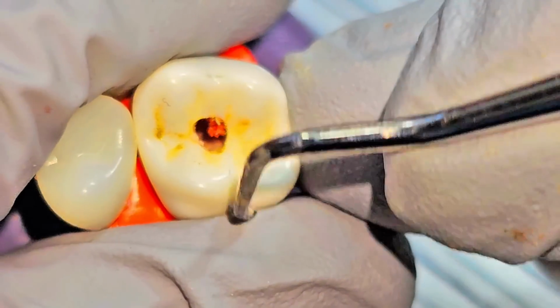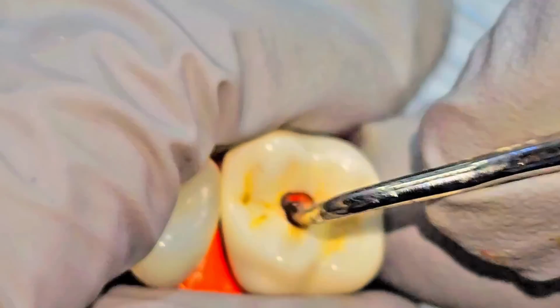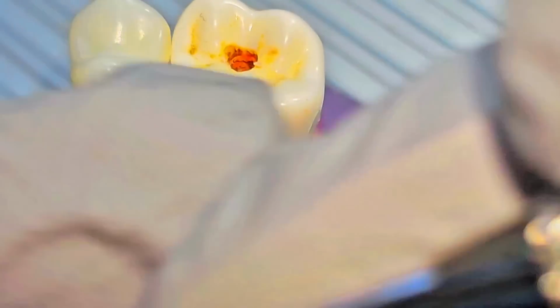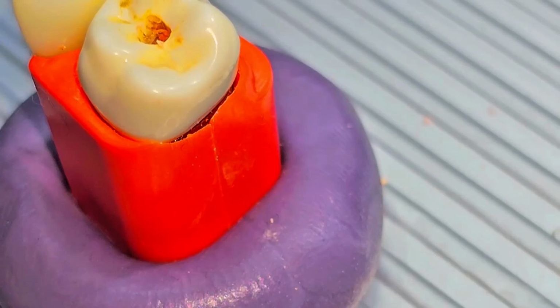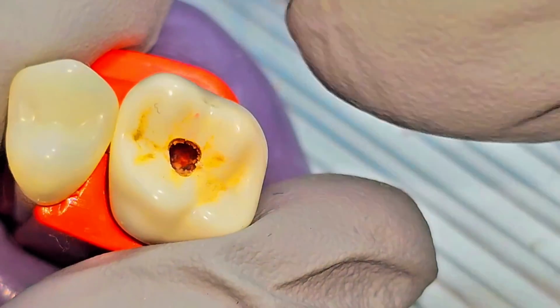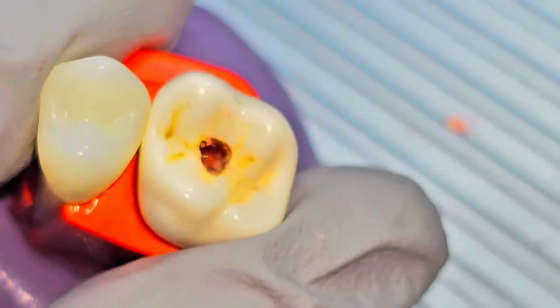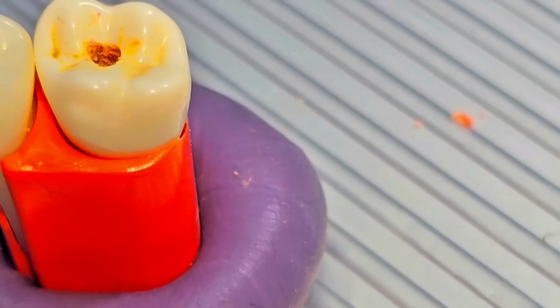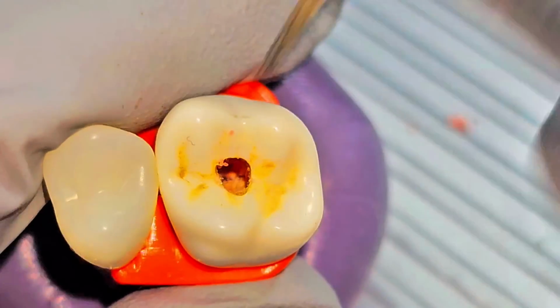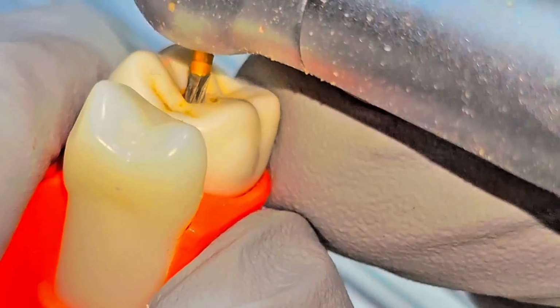And this is the formula that will make your life way easier and provide a good result. So now I'm going to continue extending. As I said, I'm going to extend here. You see how my burr is inclined?